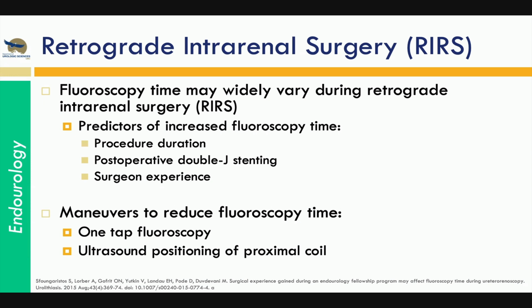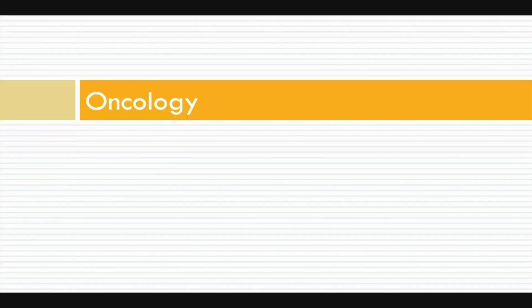All right, so we'll shift gears now a little bit and review the literature on the current clinical applications of ultrasound in oncology specifically. Traditional B mode and Doppler sonography have been the mainstay of GU tract imaging for many years, in most centers the imaging modality of choice, and still is. A lot of these emerging clinical applications aren't widely used. And I don't think it's necessarily because they're not effective, but because of institutional limitations in acquiring the necessary bits of equipment, really.